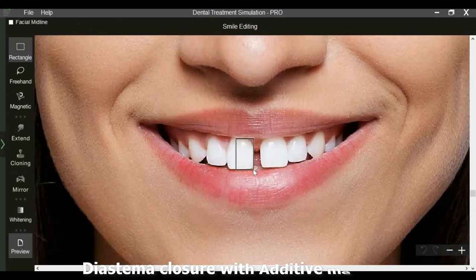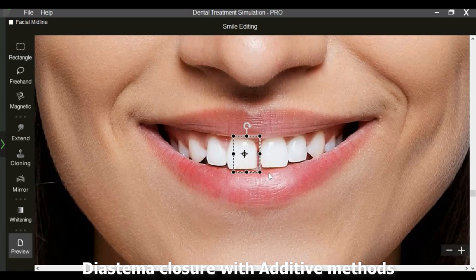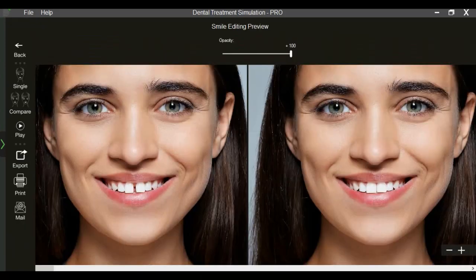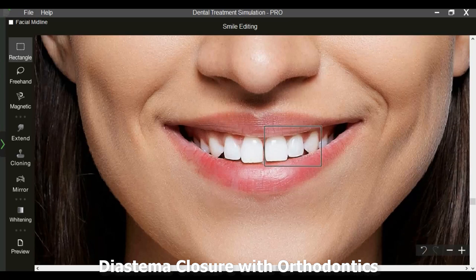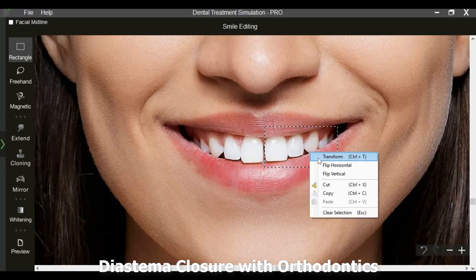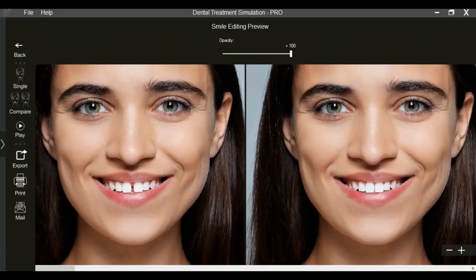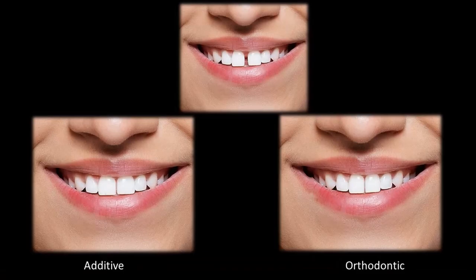One important application of DTS Pro is that it simplifies patient decision making. For example, diastema closure can be simulated with additive procedures such as composite bonding or veneers. The same diastema can be closed by selecting and moving teeth, simulating orthodontic treatment. Two different treatment options for the same patient makes it easier to visualize, leading to better decision making and greater case acceptance.